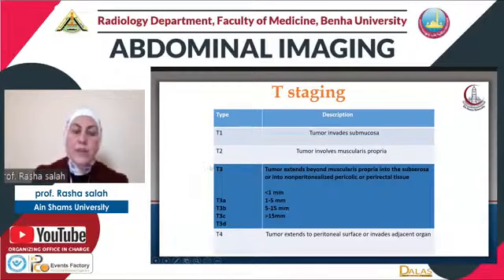But MRI is very important in staging of T3 tumors, because there is a tumoral extension beyond the muscularis propria. As we are going to see later, the extension of the tumor discriminates the T3 stage into 4 substages according to the depth of invasion of the tumor into the surrounding mesorectum.